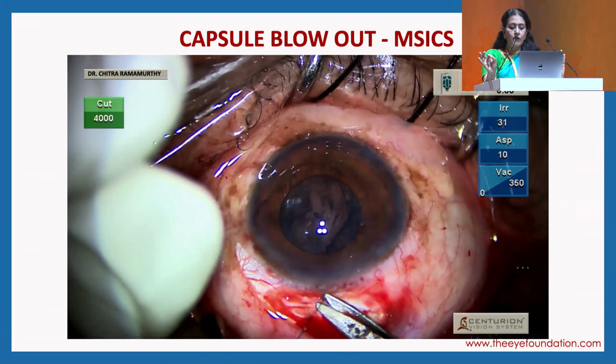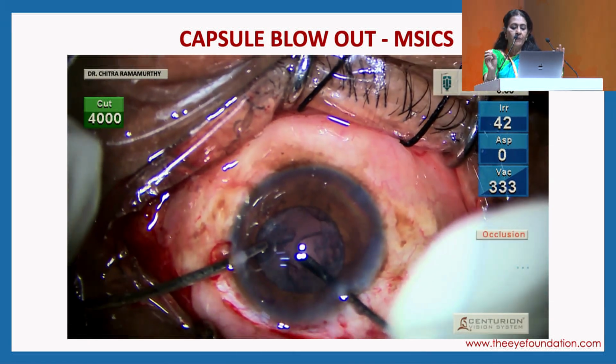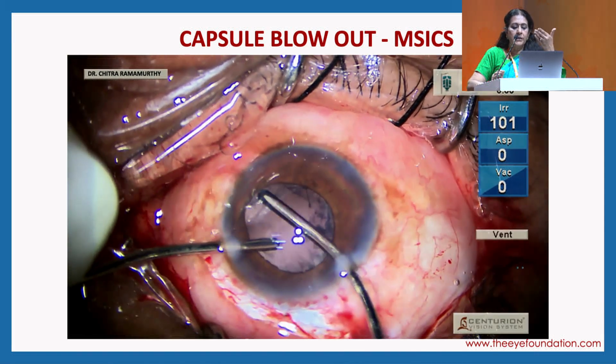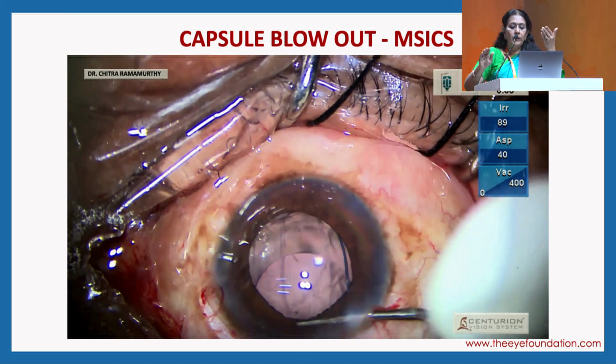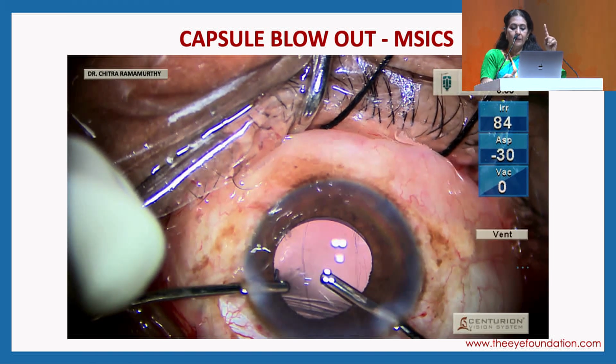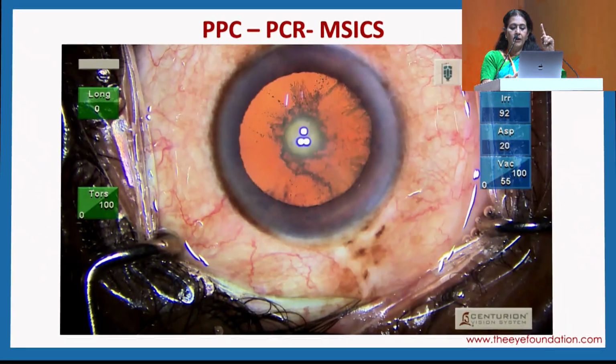I would have to suture my main port incision and then do a vitrectomy, ensuring that my IA is directed towards the corneal endothelium, not hydrating the vitreous, and then I place my 3-piece lens, but here I can't do an optic capture because I have already enlarged the rhexis.